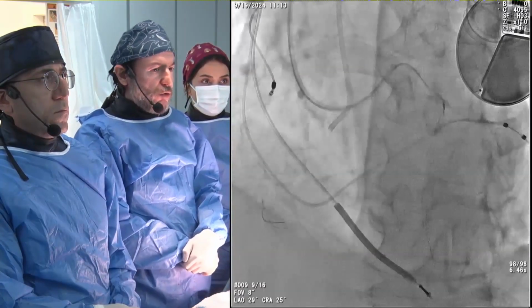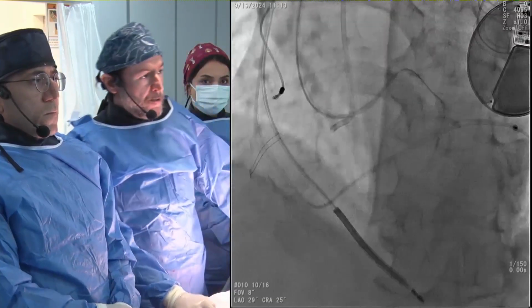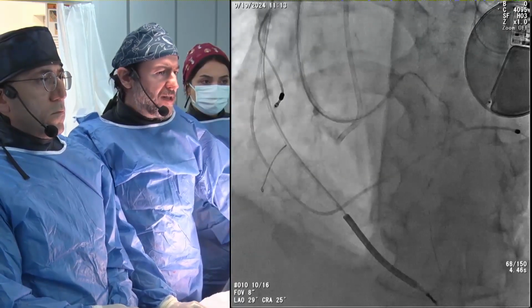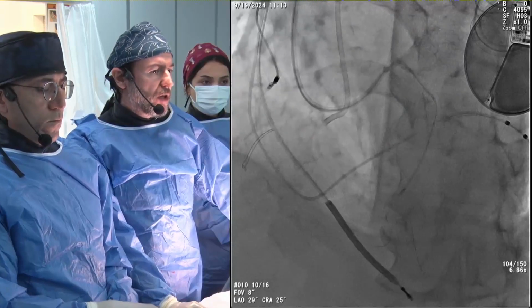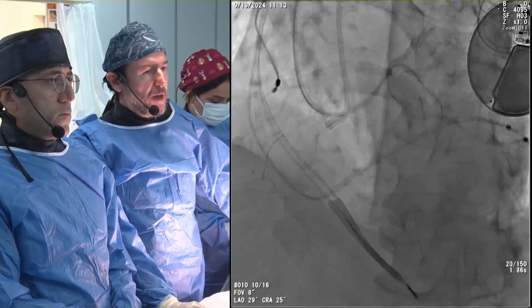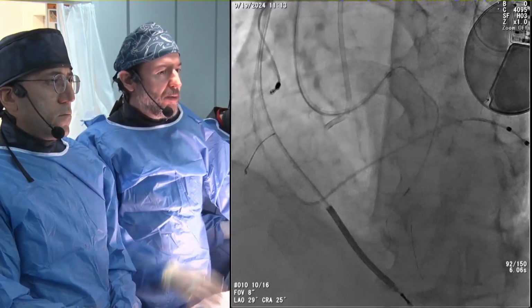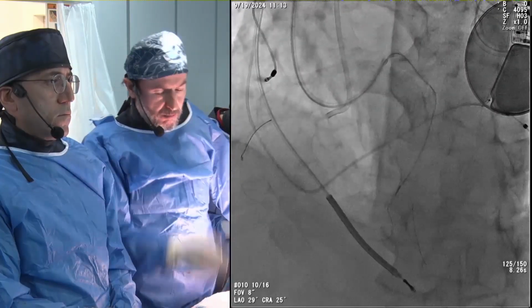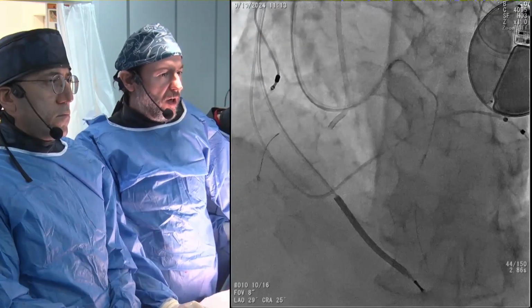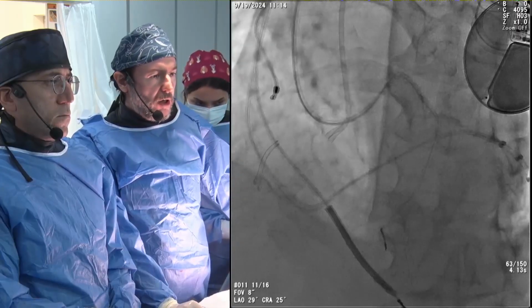And I want to show you how this microcatheter is advancing. The next one, please. This is a coiled microcatheter. It's like the Corsair Pro, but it's a little bit different. It has a PTFE coverage in the proximal part, and the coaxial support is good for me. Maybe I haven't used it as much as Masaya Sensei has used the Corsair Pro, but I feel better with this one when I go into very tiny septals, and therefore this is now my default microcatheter.